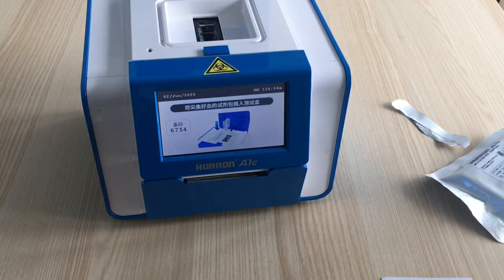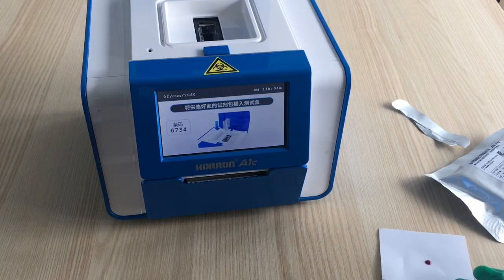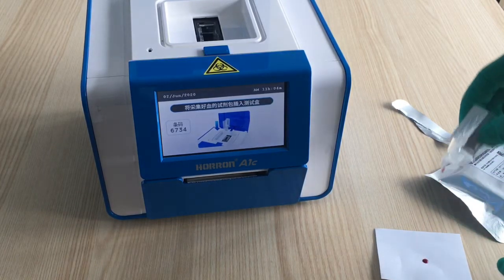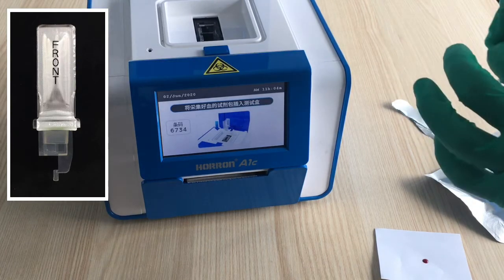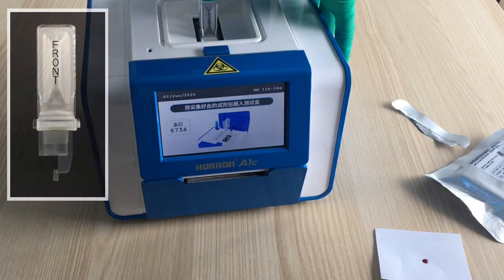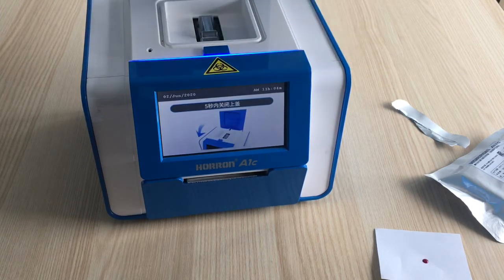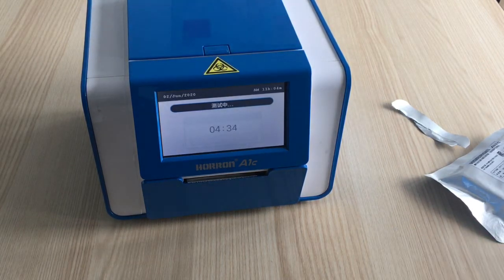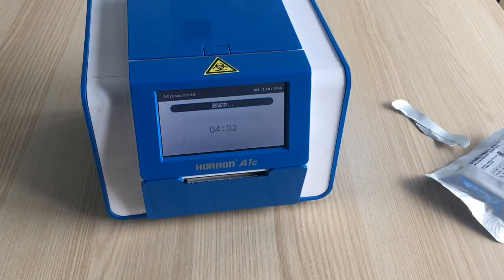Now let's take the sample. Use the reagent box to take it. Please pay attention: this side is in the front. Then we just need to wait.